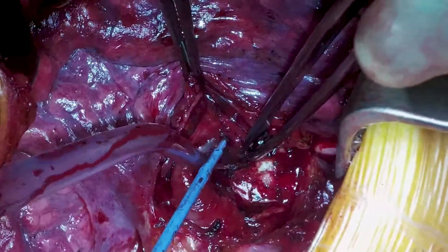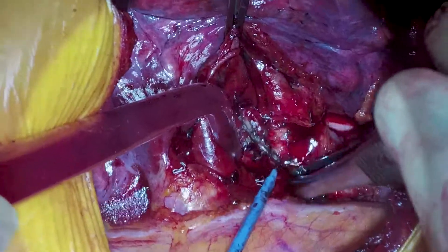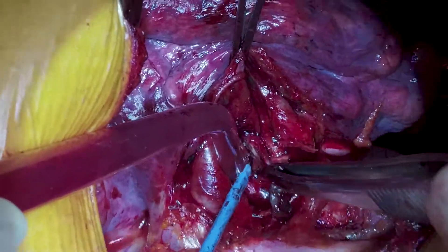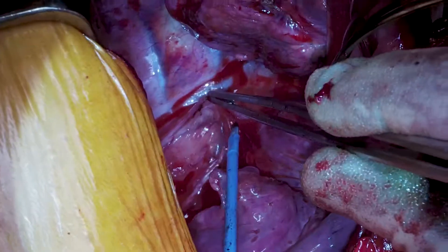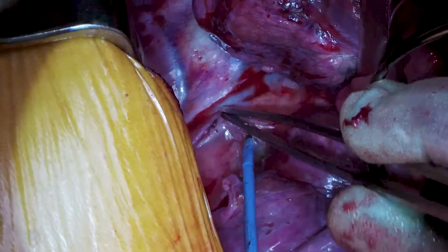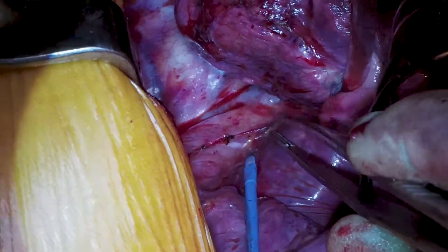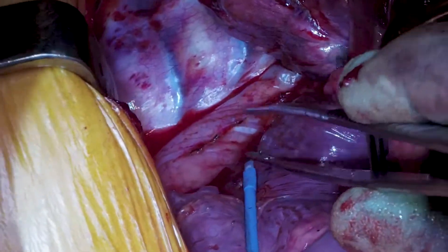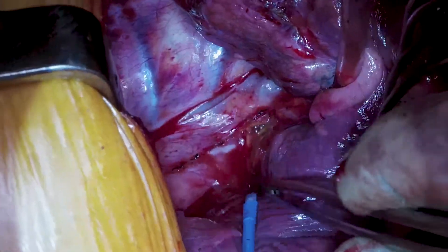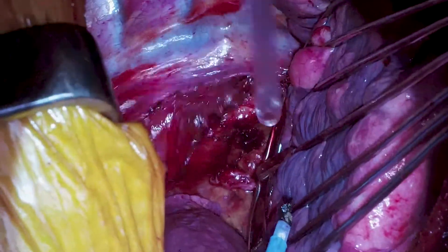Due to video time constraints this shows the removal of R11 — just below the sucker you can see the pulmonary artery and we were dissecting away some of the lymph nodes here. This also shows a really good view of the right vagus nerve as it looks in a living person, because typically in anatomy models the vagus nerve appears as a dried-up yellowish structure, so we thought it'd be nice to include that for anatomical knowledge.